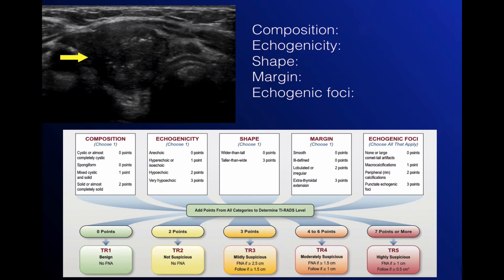Next we have a nodule that looks far more suspicious. The composition is again solid, so it receives 2 points. Echogenicity this time is very hypoechoic, relative to the strap muscles. The shape is not taller than wide. The margin is ill-defined, so zero points — it's quite hard to evaluate the margin on this one image. There are small punctate echogenic foci, so it receives 3 points for that. The total is 8 points, putting it into a TIRADS 5 lesion: FNA if 1 cm or greater, follow-up if 0.5 cm or greater.